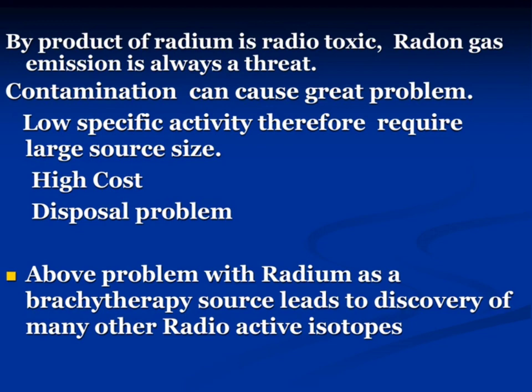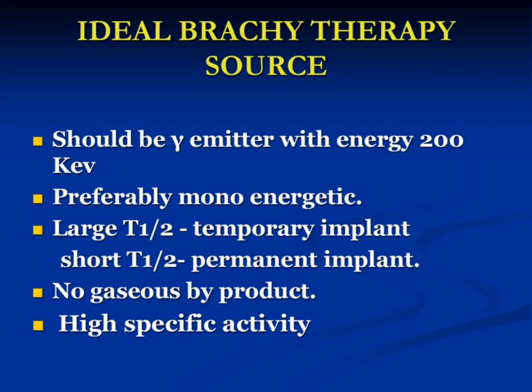Initially radium was used as the brachytherapy source, but radium has a lot of problems. A byproduct of radium was radiotoxic. Radon gas emission was always a problem, and contamination with radon can cause a great problem, along with mechanical contamination, because of the very long half-life, 1622 years.